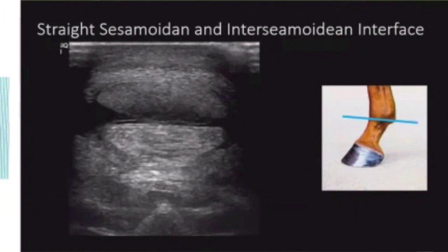One thing that I would really like to impress on you, when you think about doing your pastern ultrasound and whether you have done a complete exam or not, is, are you really getting under the ergot and getting to the base of the fetlock? Because things happen in this area, and it's a challenging spot to scan because the ergot does get in our way. If you're scanning young thoroughbreds, it's lovely because they have thin pasterns and thin skin, and you can get beautiful images. And if you're scanning a thick warmblood who has a little bit of a dropped fetlock, it can be a bit of a nightmare.